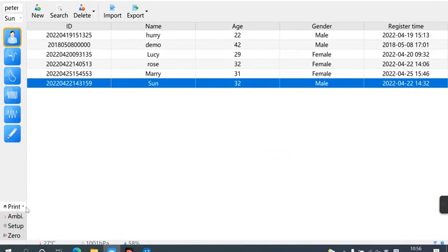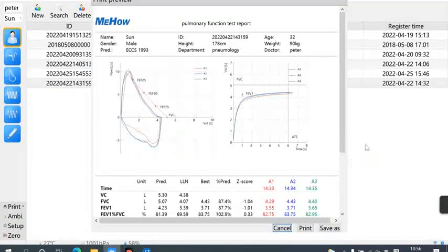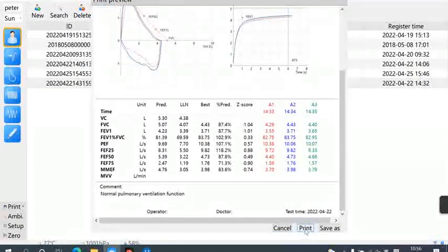Click the drop-down menu next to Print. Click the History Report, and the system will select the latest test result. Click Print Preview directly to view the historical result data. Click Print to print the report directly.